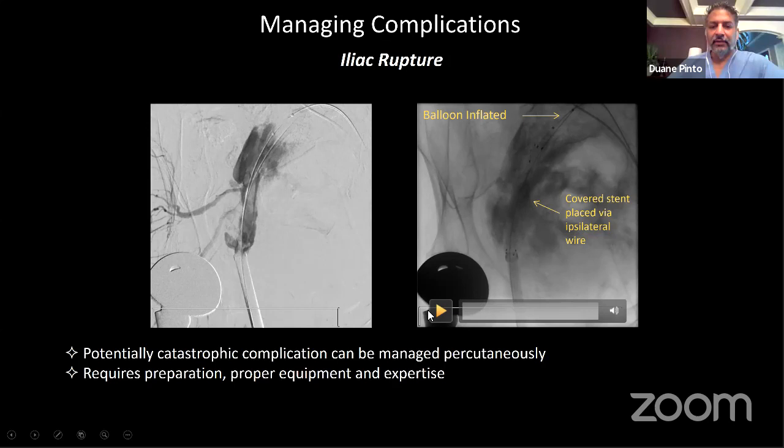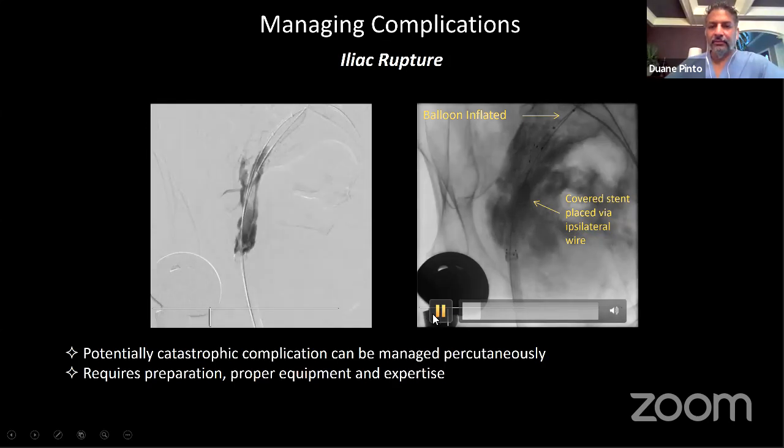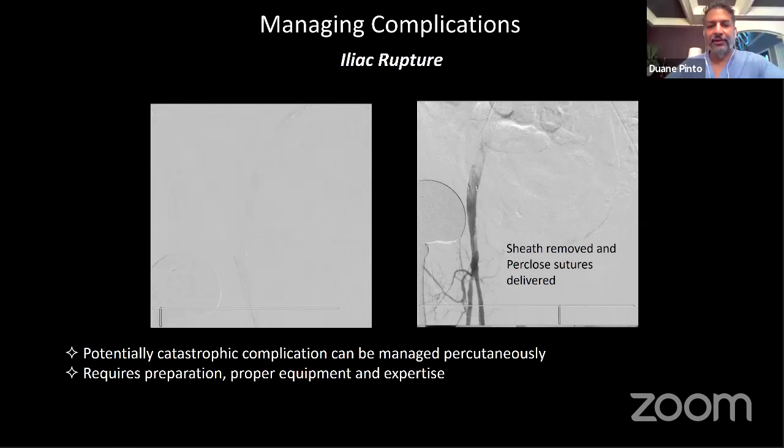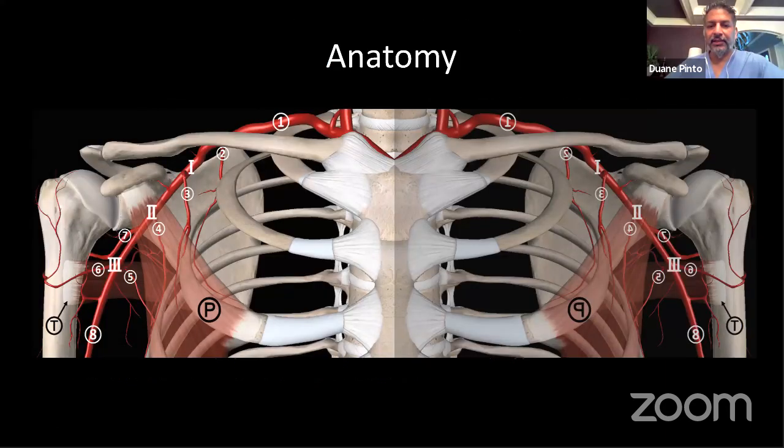Okay, let's see if we can advance here. And this is what the artery looks like after covered stent placement.